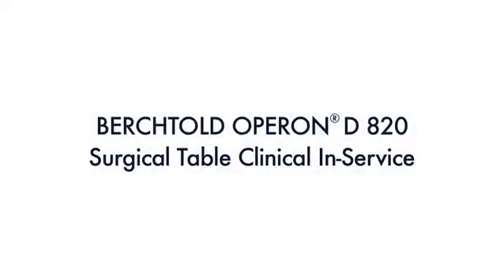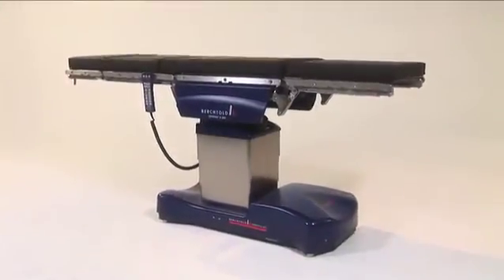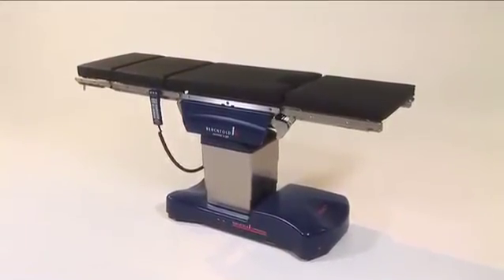Welcome to this video presentation of the Berktold Operon D820 Surgical Table Clinical In-Service. The Operon D820 Surgical Table delivers excellent value while continuing Berktold's legacy of feature-rich OR tables with exceptional functionality.